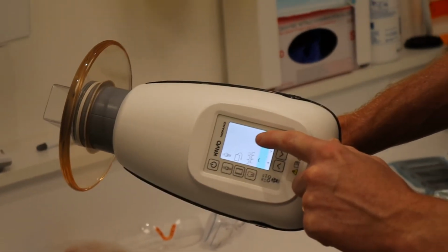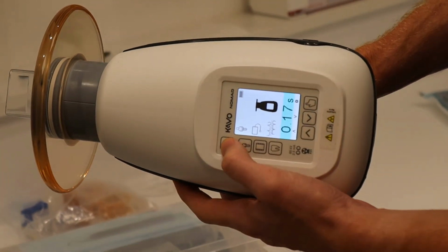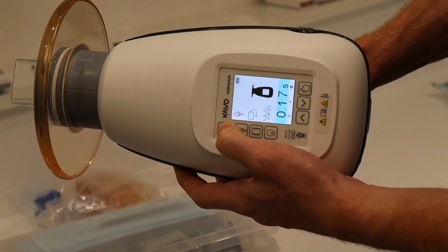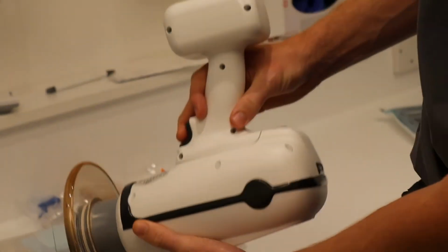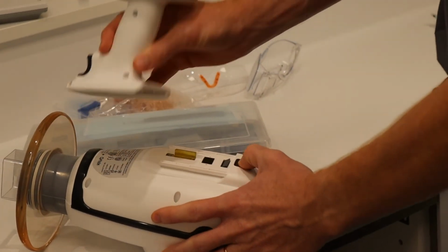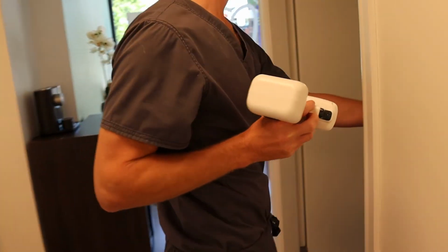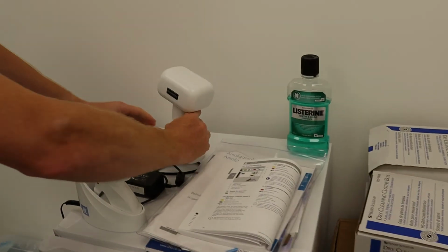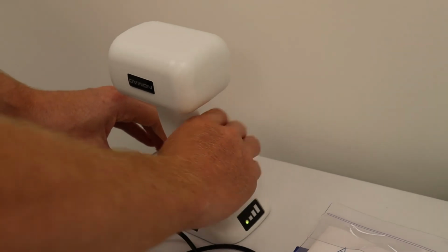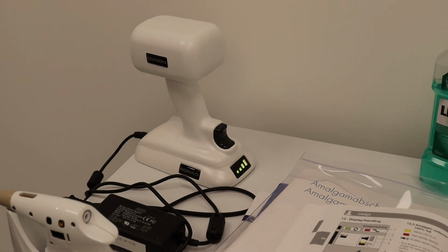It's important when using a handheld X-ray device to make sure that you're continually checking the battery level. The battery does last a long time, but it needs to be checked on a sessional basis to make sure that you've got good amounts of charge. It's very easy to charge it between patients, but if it runs low and you need to take an X-ray for that patient, it takes a long time to charge, and you're likely not to be able to take an X-ray for that patient. It's very simple. You just plug it into the charger and make sure that it's got a good connection and that you see the charging lights illuminating.